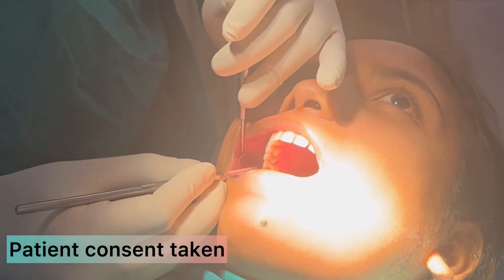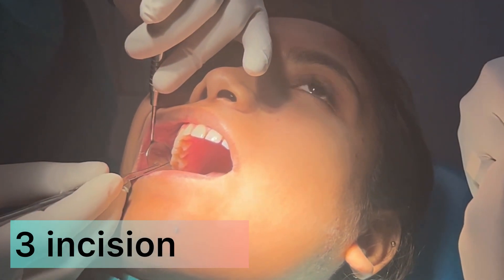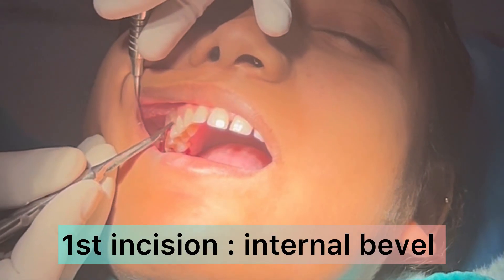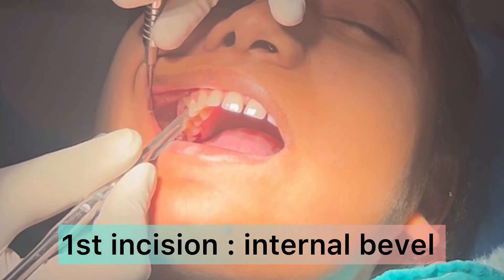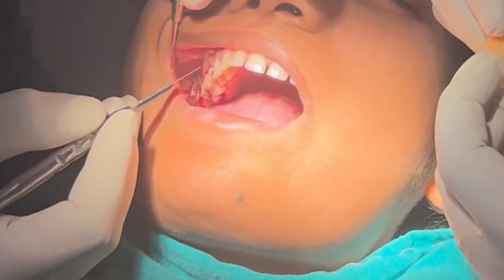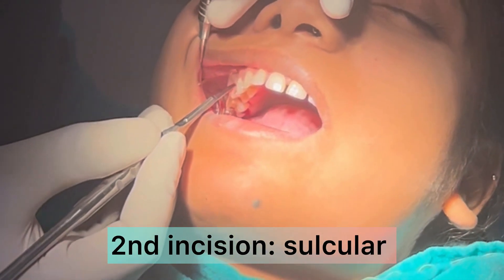Patient consent was taken for videography. There are three incisions for this flap surgery: the first incision is the internal bevel incision, followed by the second incision as the sulcular incision, and the third incision will be the interdental incision.